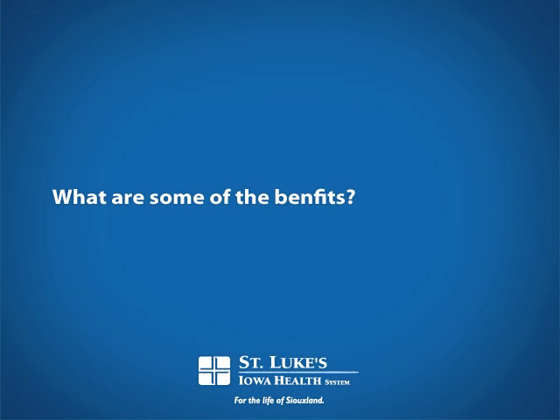What are some of the benefits after the procedure? The benefits are clear that patients are able to get up out of bed sooner. Typically, with a diagnostic procedure performed from the femoral route, patients are in bed at least 3 to 4 to 5 hours. They have some immobility and cannot move around. With the radial artery technique, patients are able to get up out of bed, off the procedure table. They're able to go back to the room. They can sit up in a chair. If they need to go to the washroom, they can. They can use their other hand to eat with, and those are clear advantages.